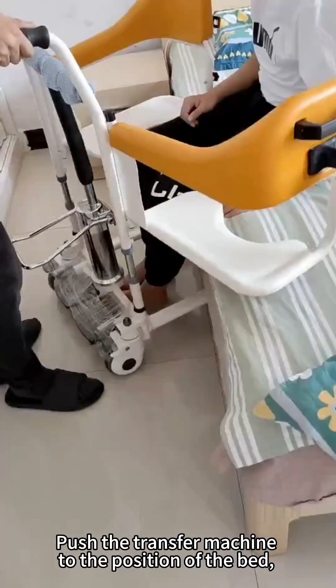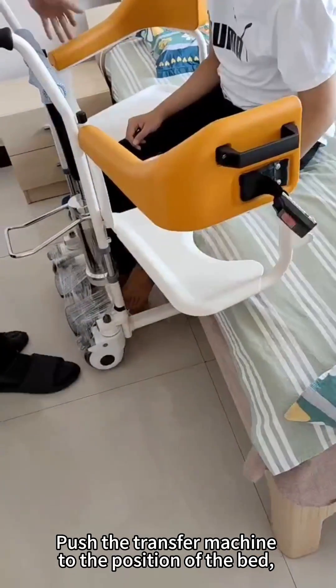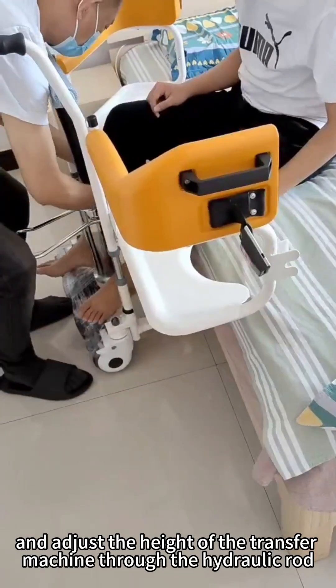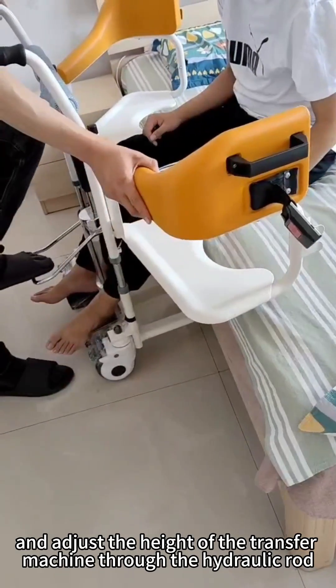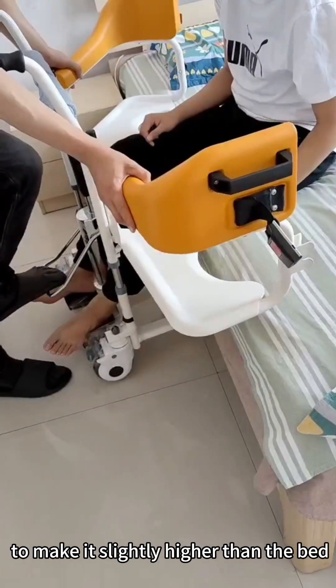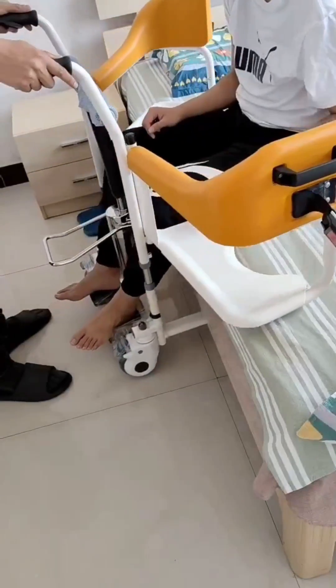Push the transfer machine to the position of the bed and adjust the height of the transfer machine through the hydraulic rod to make it slightly higher than the bed.